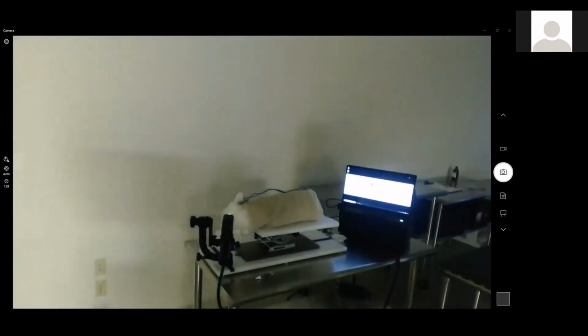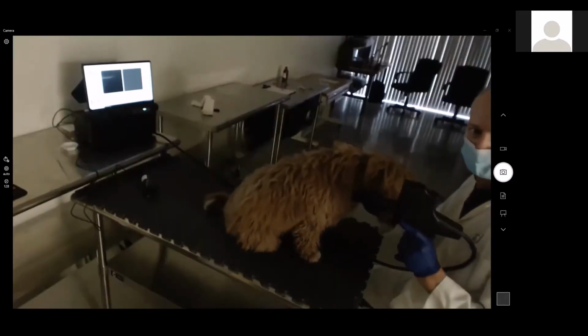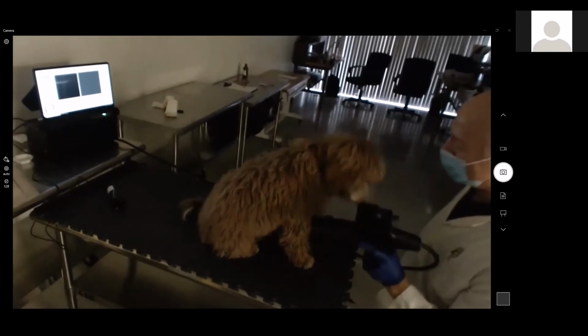Okay, so we're going to do a quick switch over here. Go ahead, we're going to pop off the video for a second. Just go switch the handle. Okay, I'm on. Yes, sir. Okay, very good. All right, so everyone, you get to observe me attempting to get an OCT on a puppy.